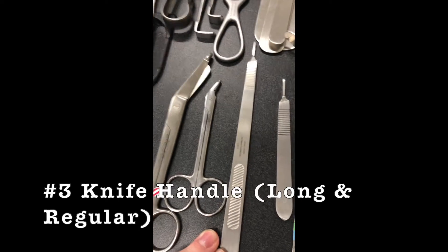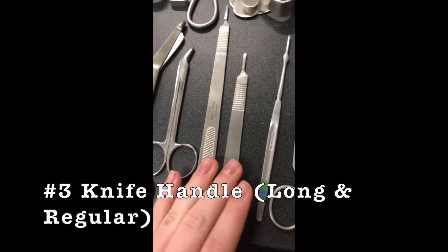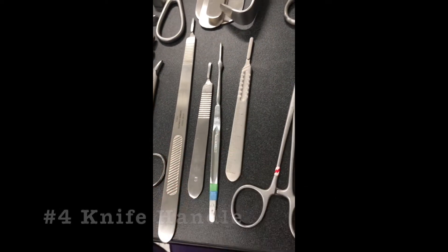And then you've got the long number three, number three, number seven, and number four.